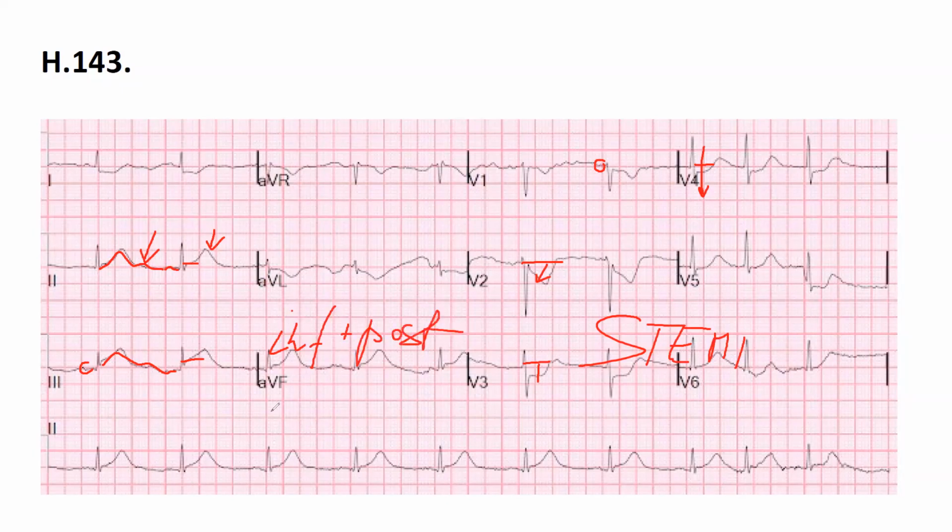That's good. And here again, we have something we discussed before: the U waves. Yes, that's a U wave. Also, a flattening of the T wave a little bit. Normally the T wave should be a little bit bigger than this one.